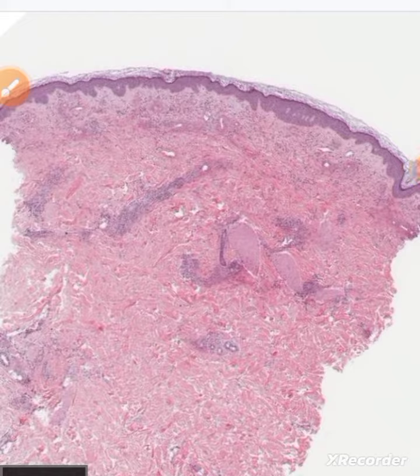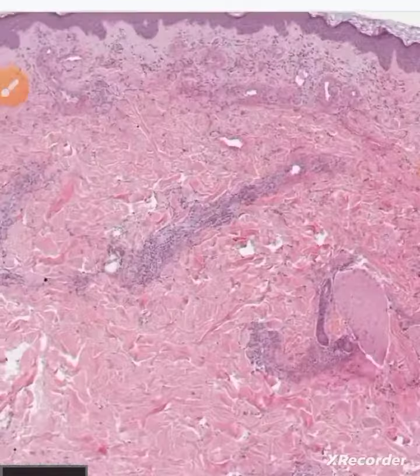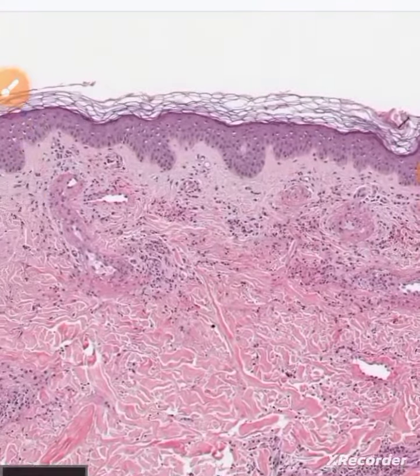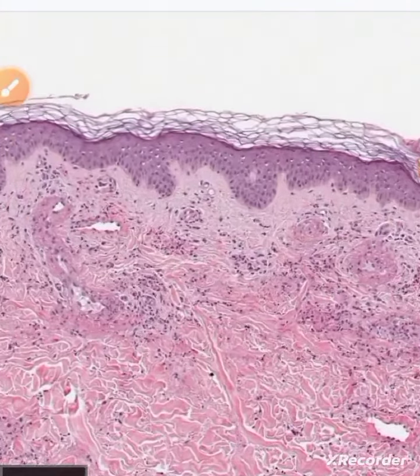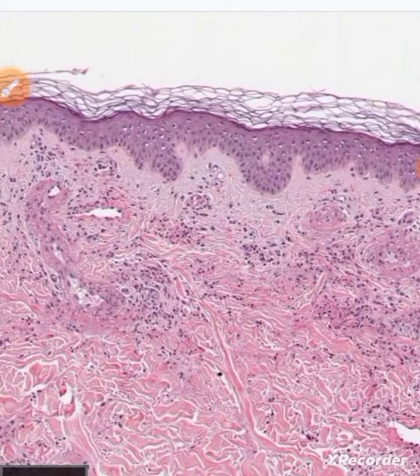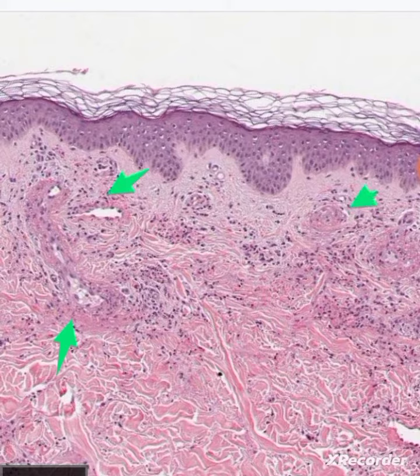This is a histopathological slide with hematoxylin and eosin stain, and on the scanner we can see that there is something going on with the blood vessels. These blood vessels are swollen and there is some pinkish material surrounding their walls.